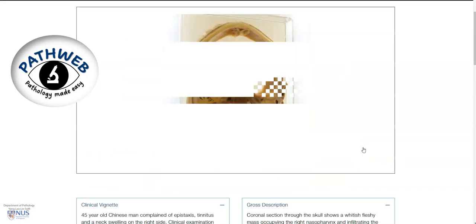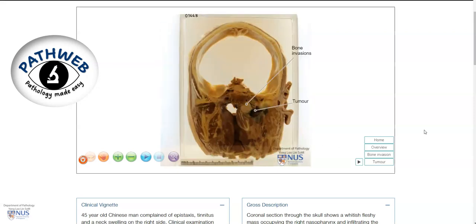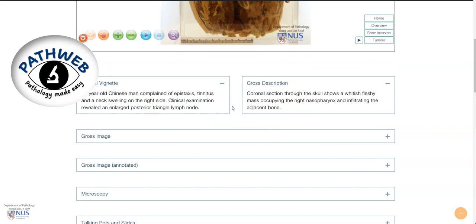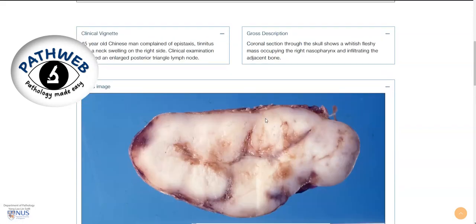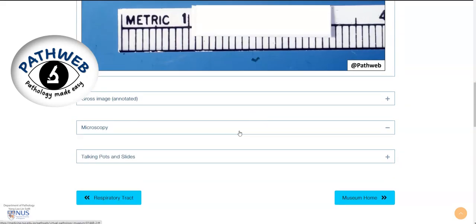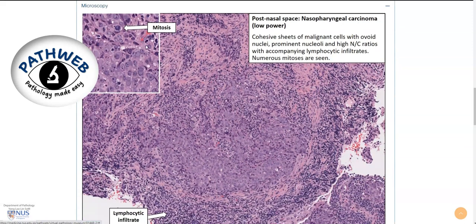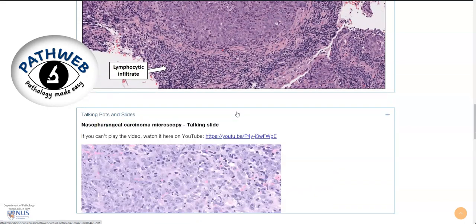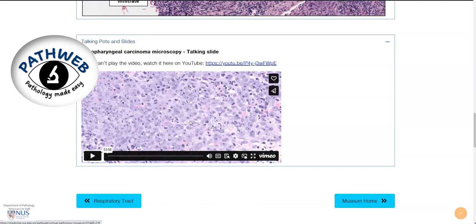This specimen also has some labels so you can explore this, and scrolling down there are clinical vignettes, gross descriptions as well as gross images, and microscopic images showing the example of an undifferentiated non-keratinizing nasopharyngeal carcinoma. Often these tumors are very closely associated with lymphocytes, and here is an accompanying video describing the microscopic features.